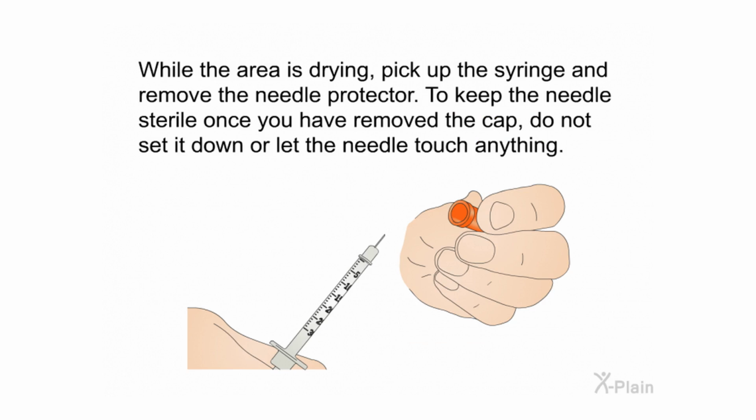While the area is drying, pick up the syringe and remove the needle protector. To keep the needle sterile once you have removed the cap, do not set it down or let the needle touch anything.